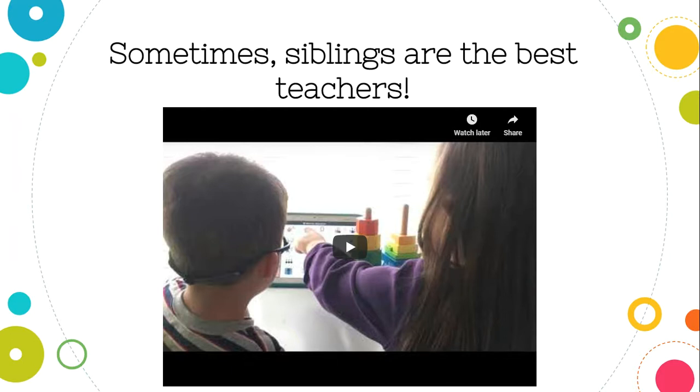If your child has a favorite toy or a favorite activity that they like to do, and you're maybe having trouble brainstorming a core word that you could model during that activity, feel free to send me an email. We can brainstorm together and try to come up with that. And I can also help put together some materials for you that might make it easier. I'm trying to help make this as simple as possible. So the easier it is, the more likely you are to do it. At least that's my opinion.